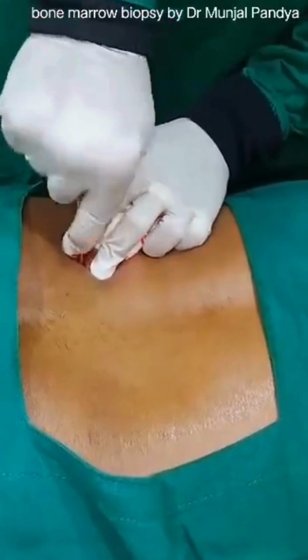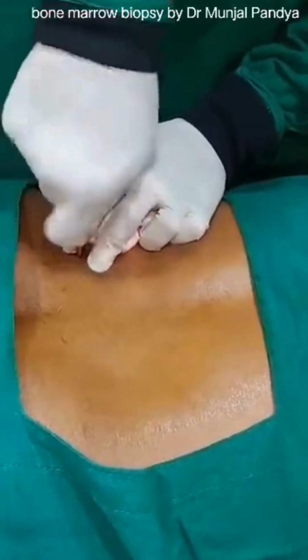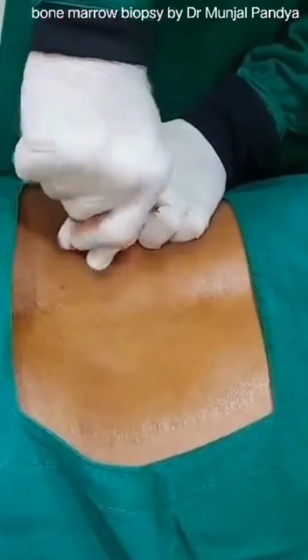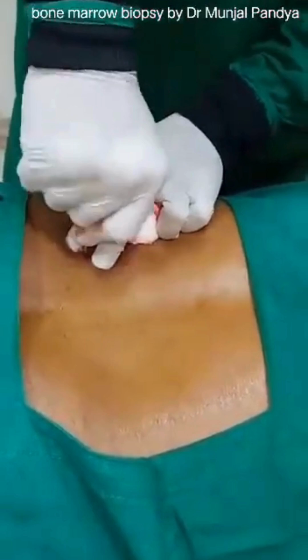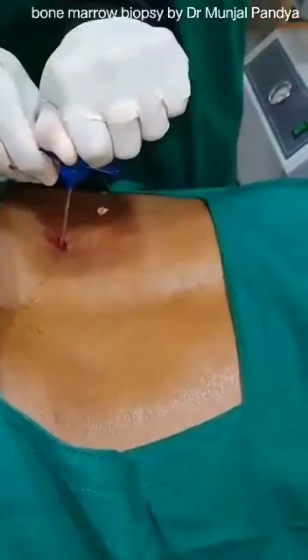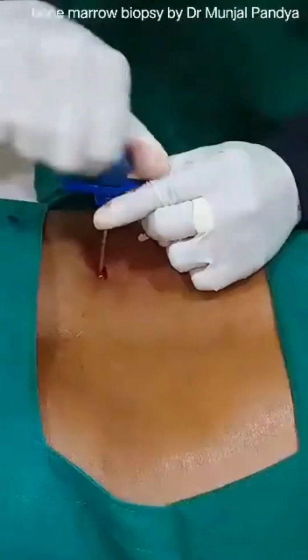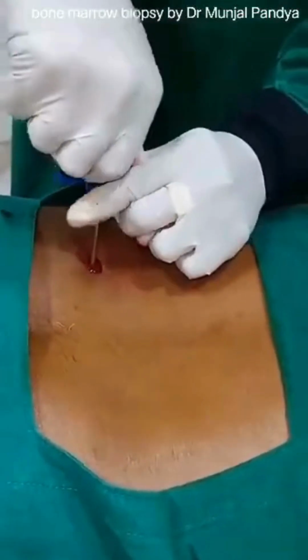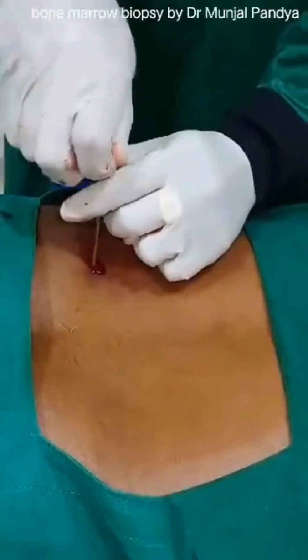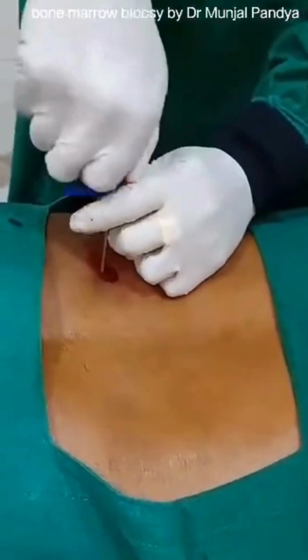So the same aspirate style, I am entering into the bone, right? The way I entered for the aspirate. Now it's in the bone. So now the difference between aspirate and trephine is that I'm removing that inside stylet from the needle.